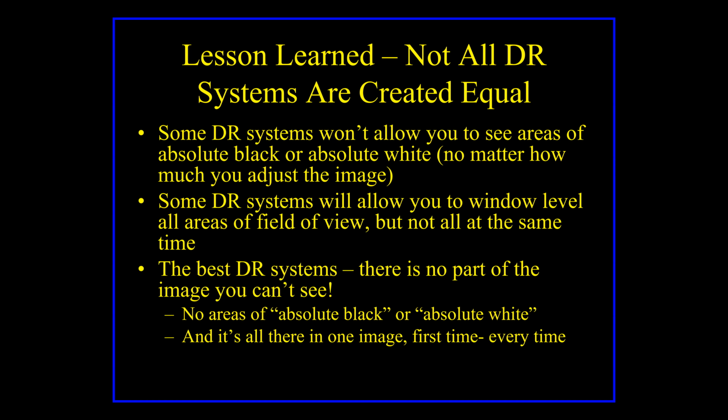Not all DR systems are created equal. So if you go to buy an X-ray system, just because they say it's a DR flat panel doesn't mean they're all going to be really good. There are some that are not very good and some that are super good. Typically the ones that aren't very good are lower in price, and again, it comes down to that same old thing: you tend to get what you pay for.